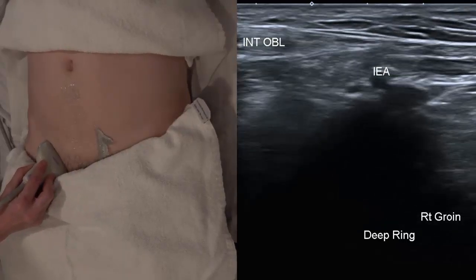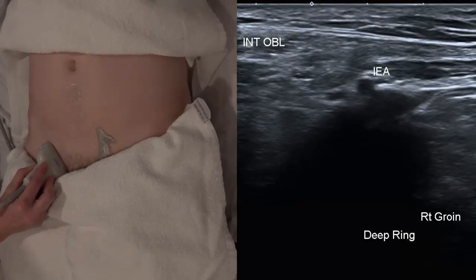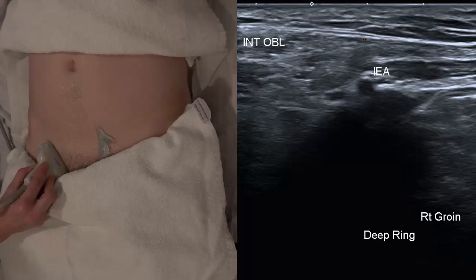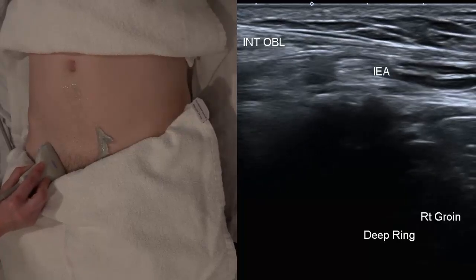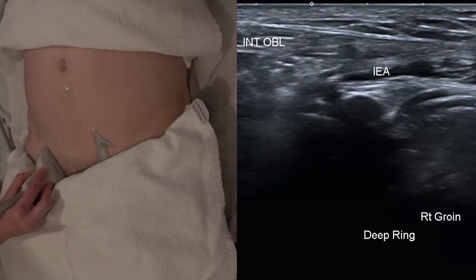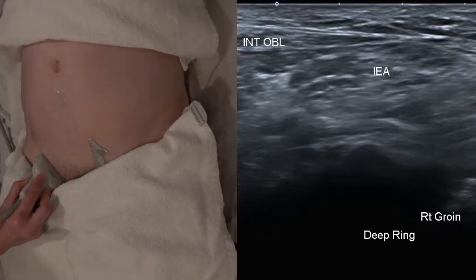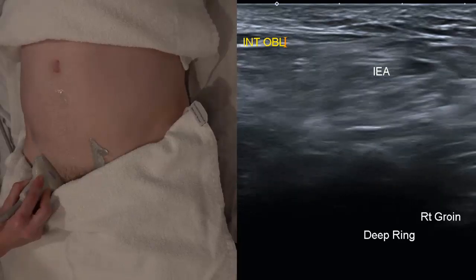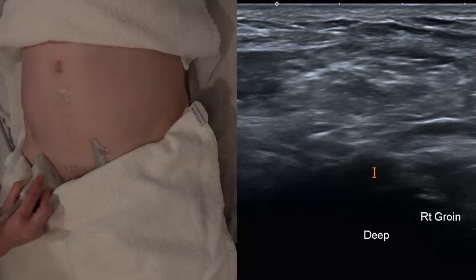If something's coming through this location we know that it's an indirect hernia — it's obeying the rules of the abdomen, using the door of the inguinal canal and traveling through the inguinal canal with the spermatic cord in the male, or in the female the round ligament and associated veins. We need to do it a few times as it's very easy for the probe to slip off medial or lateral and for you to miss this.